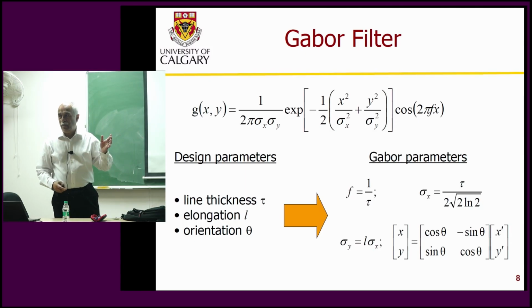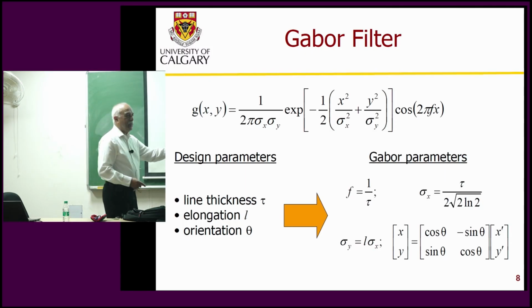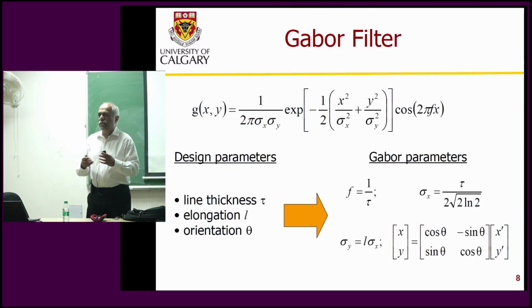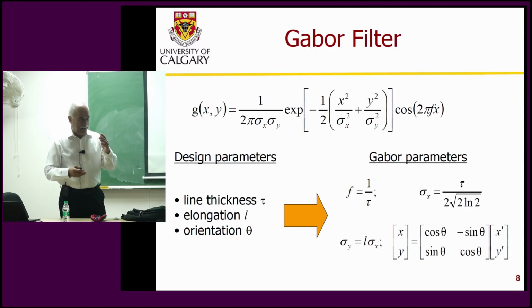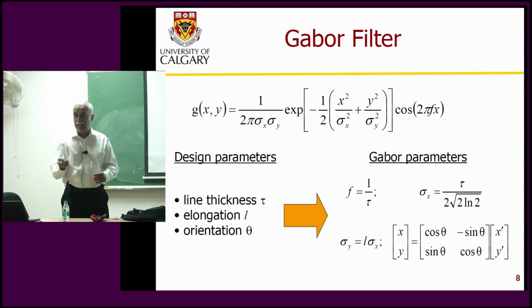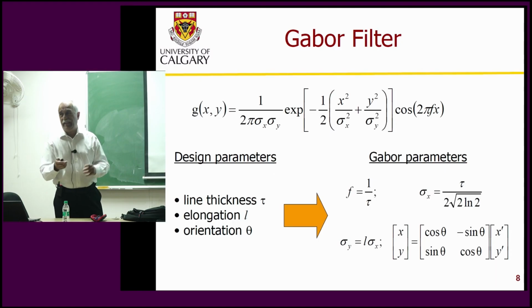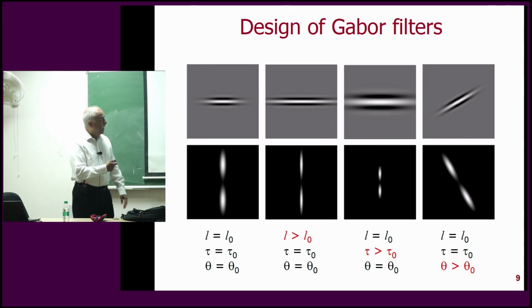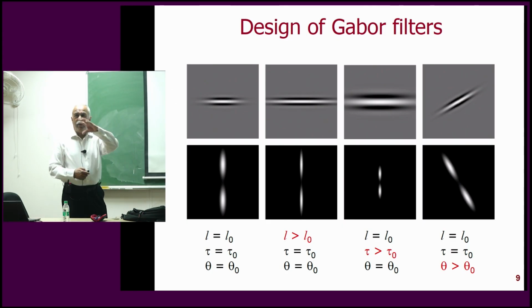So how many scales do you want? How many values of L? Is it important to change it? Do the results depend on that? So you have to analyze and find out how many angles you want, how many filters. Do you want 180? Do you want 90? Will 45 be enough? Those are questions of implementation. I showed this. I'm repeating some because I don't have all of you all the time, but I'll go through quickly those that have.